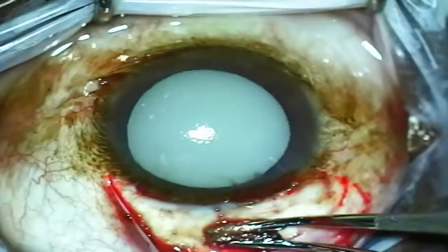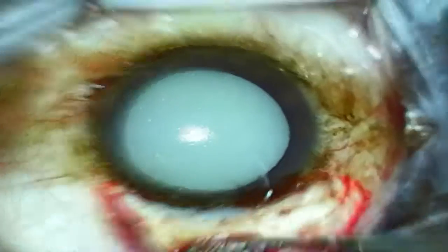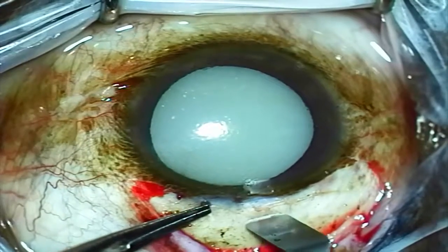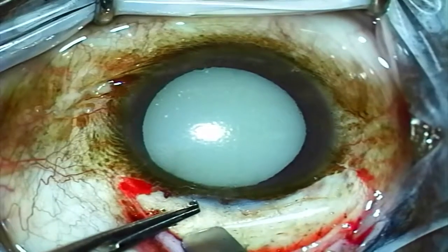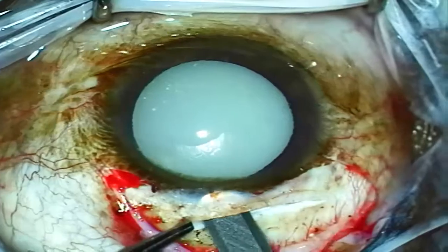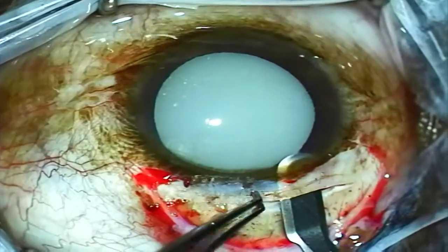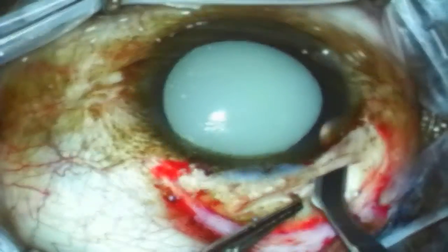Here I've made a conjunctival peritomy superiorly and then used some electric cautery. Next I'm using a crescent blade to measure a few millimeters back from the limbus and then create a frown-type incision. The creation of this incision is very important to ensure that the wound is self-sealing. The crescent blade is used to dissect into the clear cornea, and this incision is wider internally than externally, which helps to seal the incision at the end of surgery.